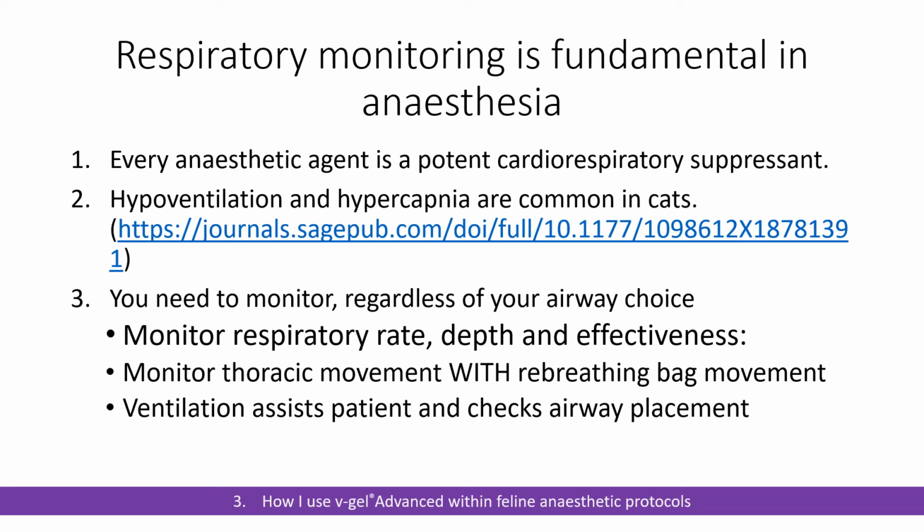So ventilation is something that helps your patient out. Certain things that we do with the patients, like using troughs or compressing the chest or restraining limbs in particular positions for radiography, can all make it quite hard for the patient to breathe. And that means that patient may not be excreting carbon dioxide as well as they should, and that can build up anaesthetic risk very, very quickly.